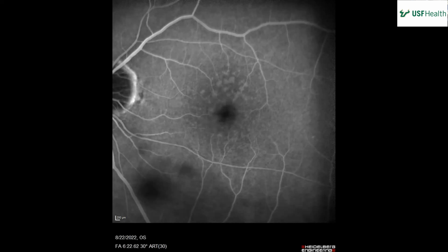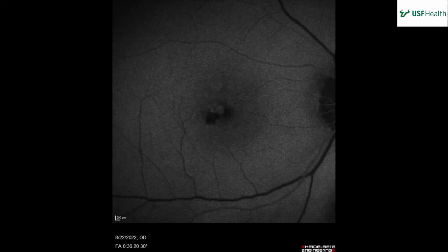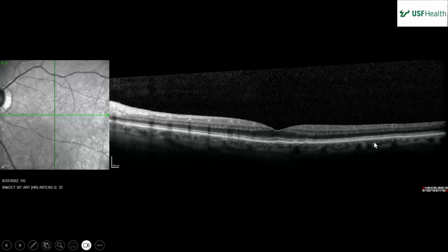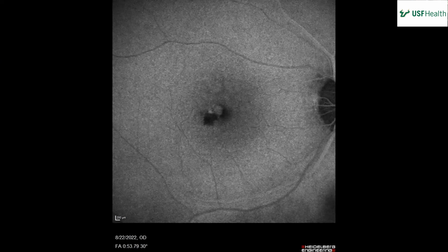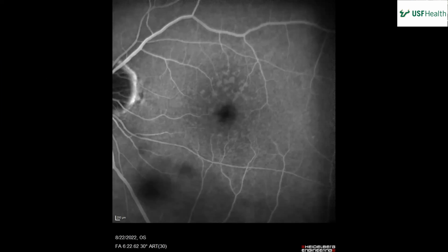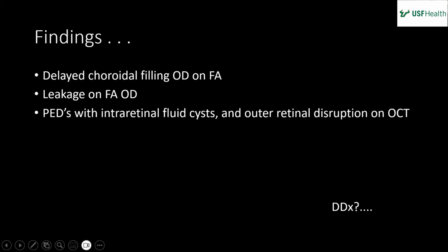Well, somebody got this wrong once. Do you know where the blood retinal barriers are? The RPE. If you look at your drusen, the RPE is above them, so they've got free access to the choriocapillaris. So the fluorescein is going to go into those. And so that's good. Somebody didn't know that years ago and almost gave me a heart attack. All right, good.